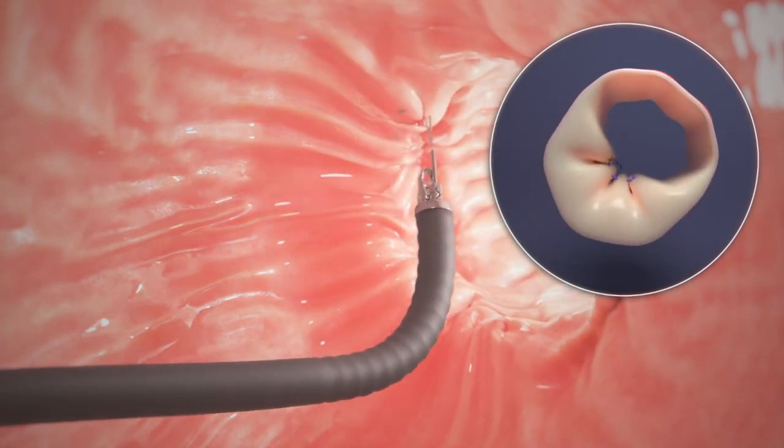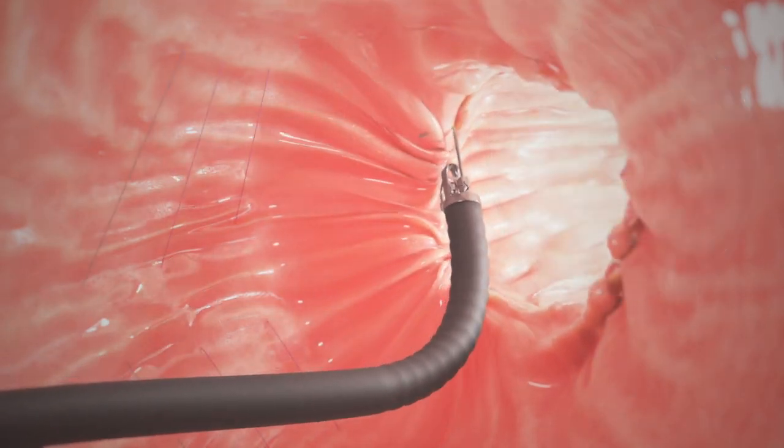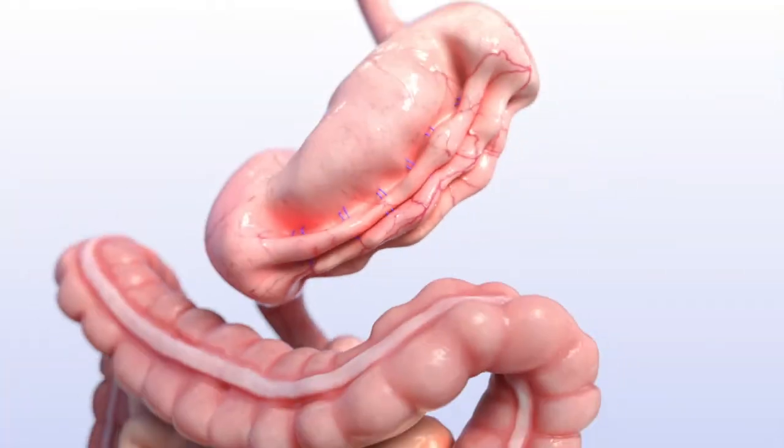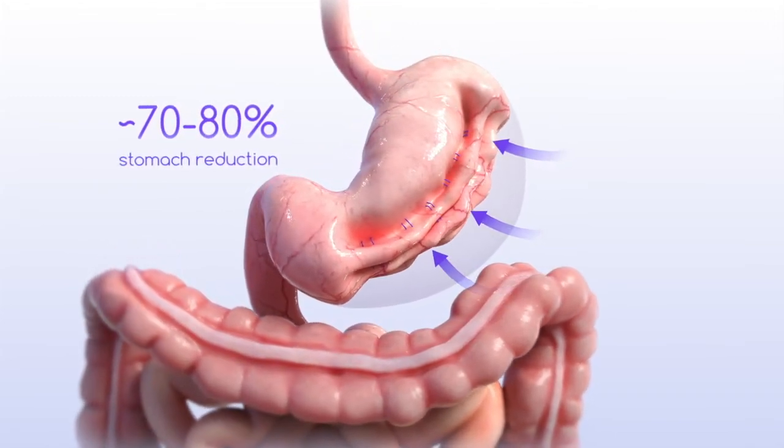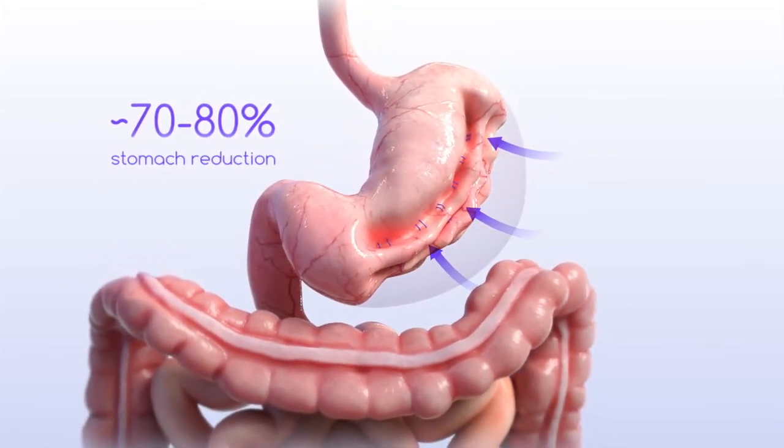The doctor continues to sew along the large curve of the stomach until six to eight sutures are completed. With your stomach sewn into a smaller shape, you'll eat less and feel full faster, resulting in significant weight loss.